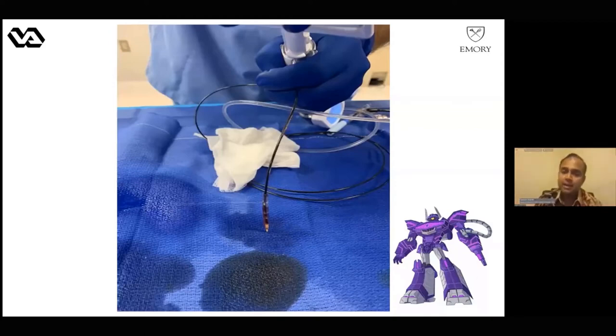We never made it higher than 3 atmospheres. And this was our first area that we treated. Now, subsequently, we've had a few ruptures with the coronary shockwave as well, and they have been generally with more treatments.